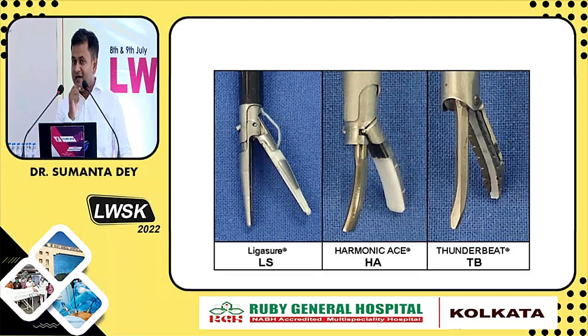If you have monopolar devices in your OT setup, you should have one bipolar device in your OT setup as well. And if you want to do advanced laparoscopic surgery, I would recommend that if you want to buy anything, buy any one of these three: either LigaSure, or Harmonic Ace, or Thunderbeat.